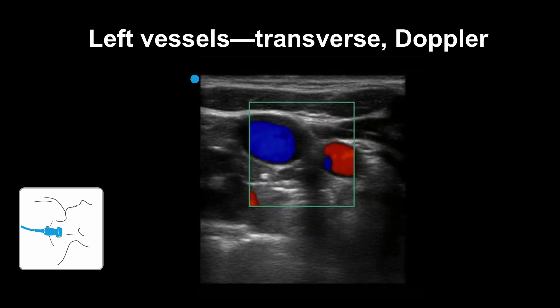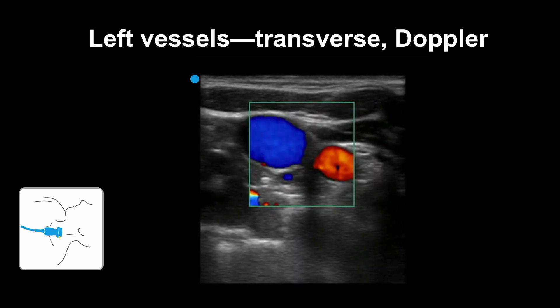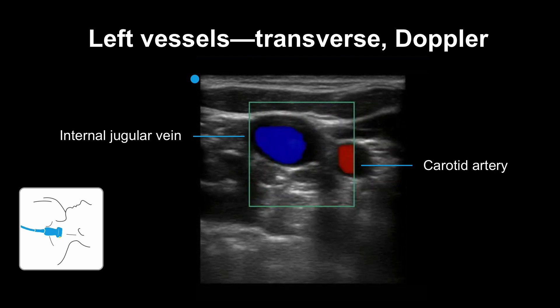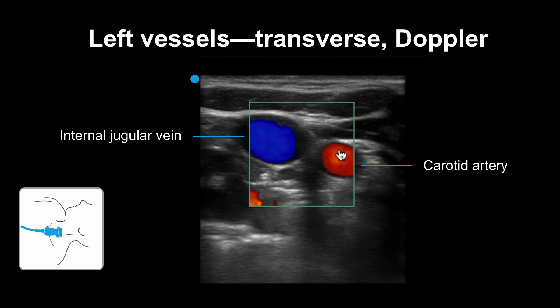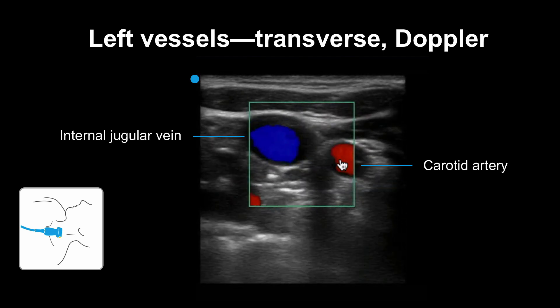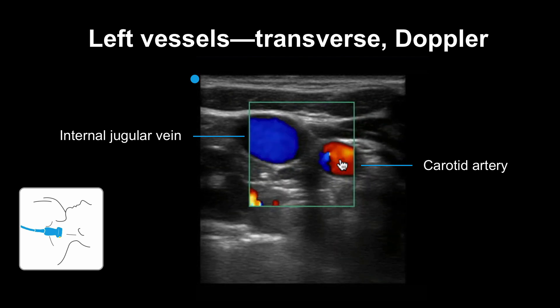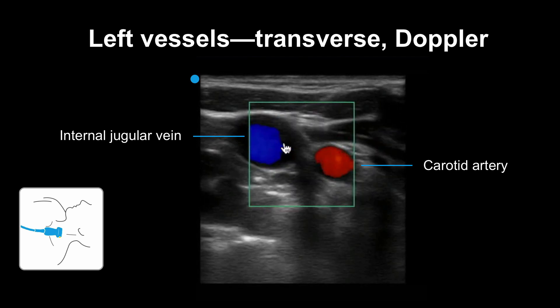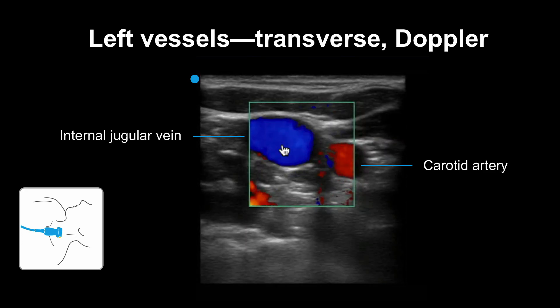Here is that same view approaching on the left. This time the operator has used Doppler over the vessels. Here again you see the internal jugular vein and the carotid artery lighting up on Doppler. The artery appears red, which means that relative to the probe, there is blood flowing towards it in this vessel, compared to the vein which appears blue because the blood is flowing away from the transducer.